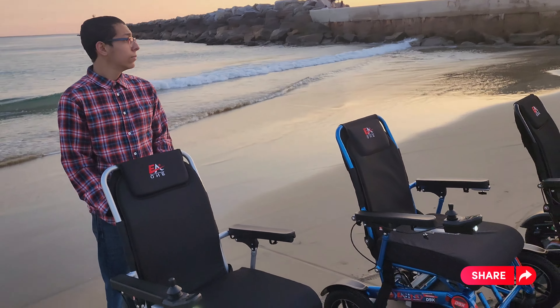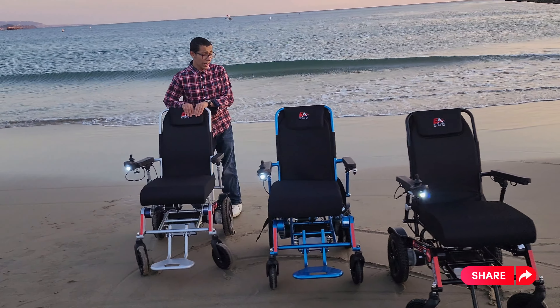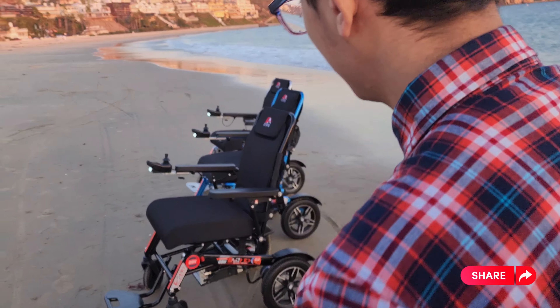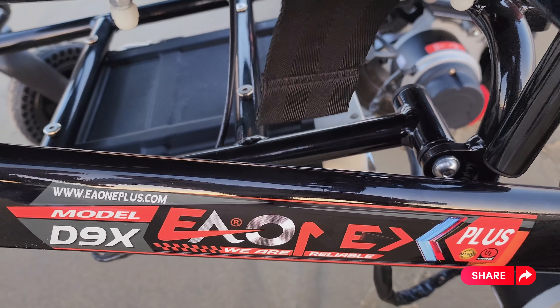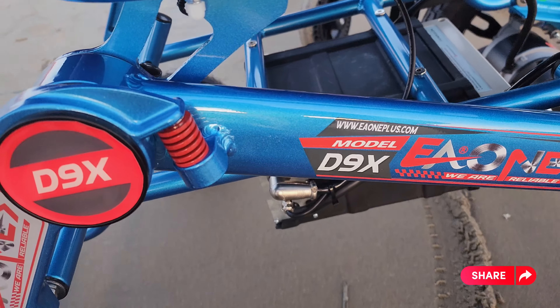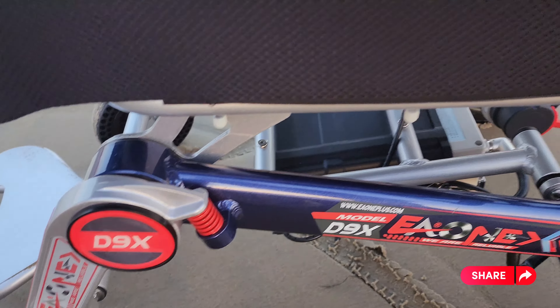This is the EA1 Legend of the Air, D9X Pro model. Blue model — nothing like it on the market. Here is our black — it's like the Mercedes-Benz colors, a nice glorious black. Also a lovely blue and a dark blue, both very good.